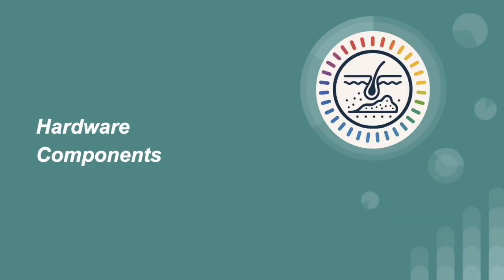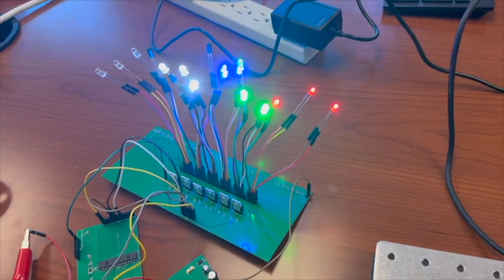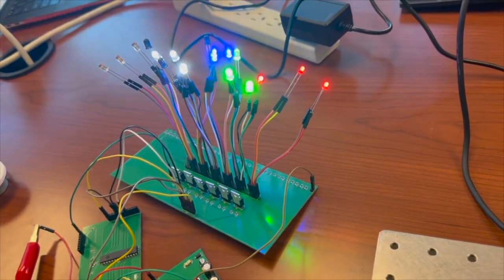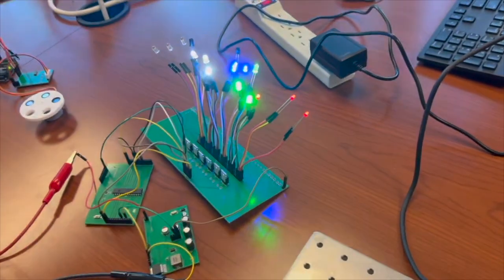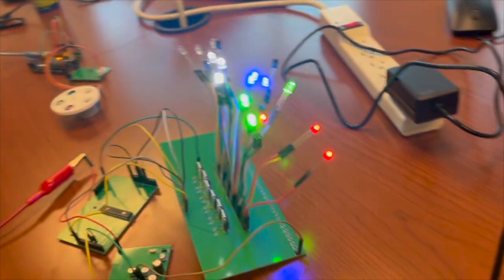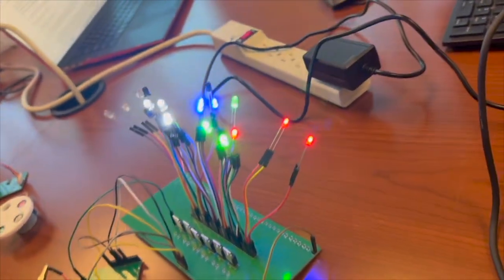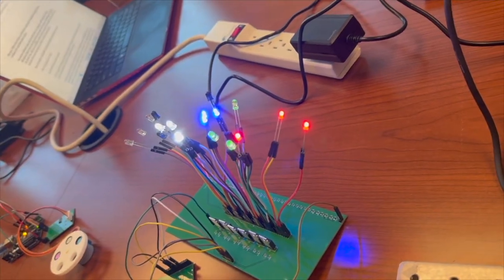Now we'll be moving on to the hardware components. This is the LED driver board. It is equipped with 6 N-channel MOSFETs, each capable of controlling up to 6 LEDs. In total, the system supports 36 LEDs: red, green, blue, white, 940, and 850 nanometer infrared wavelengths. The brightness of each LED is individually controlled using pulse width modulation, allowing smooth fading sequences as demonstrated here.